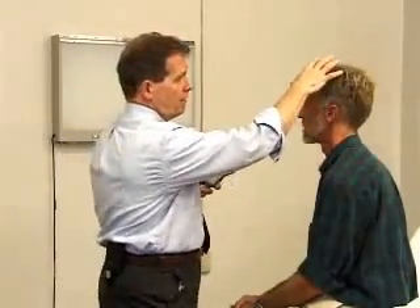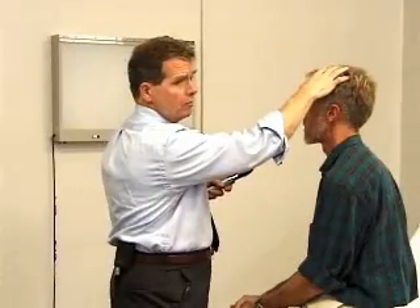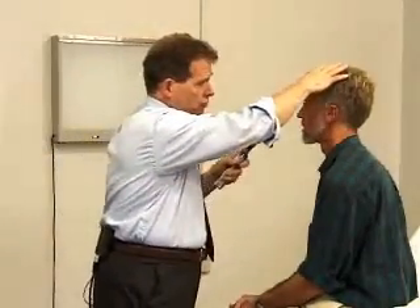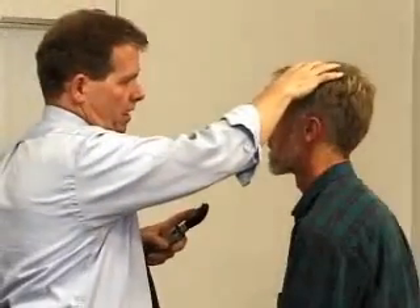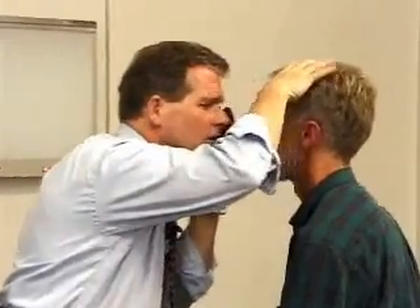For holding the instrument, you generally should hold the scope in the same hand as the eye you're examining — so for Bill's left eye, I'll hold it in my left hand. The second important piece is to place your hand on the patient's head with your thumb above their eyebrow. This gives steadiness to the exam and lets you concentrate on looking through the scope while your proprioception tells you exactly where the patient is. Not touching the patient at all is hazardous because the examiner can easily bump into them. Hand above the eye, hold things steady — left hand for a left eye, right hand for a right eye.